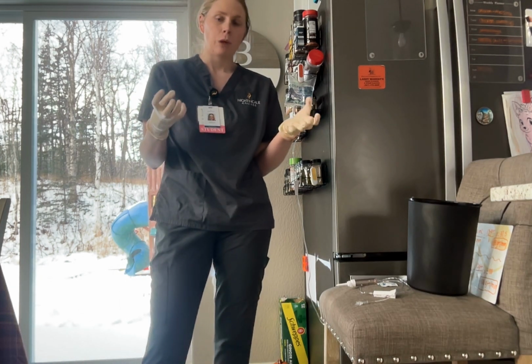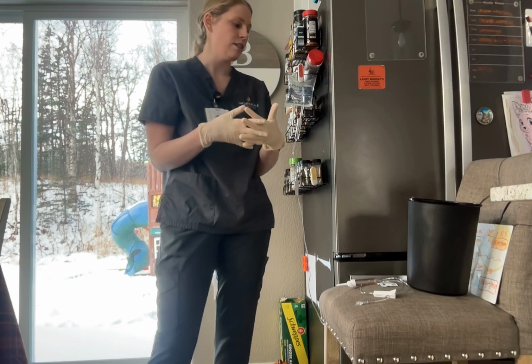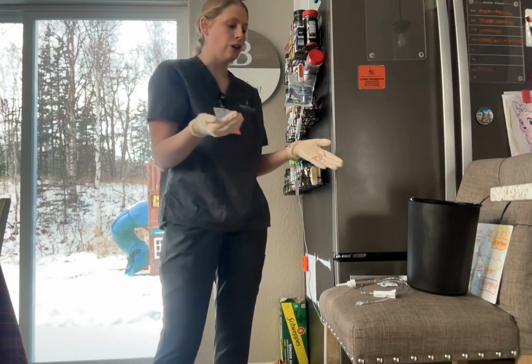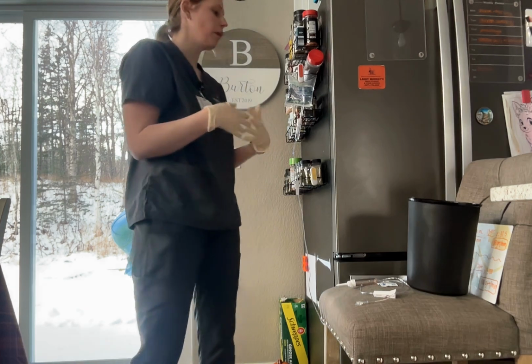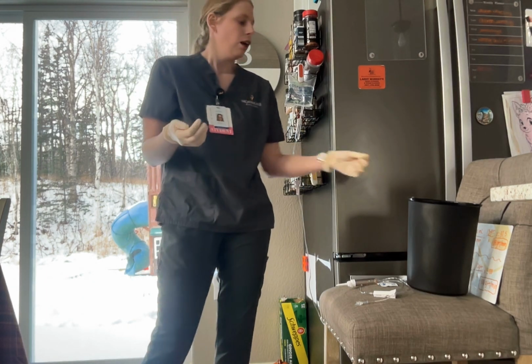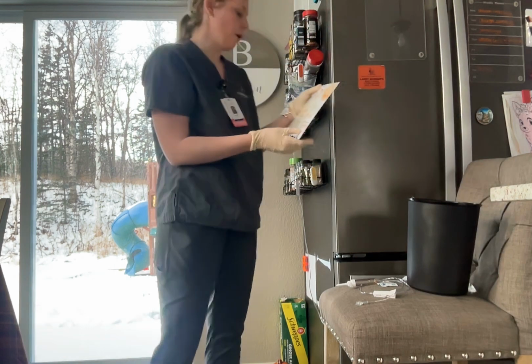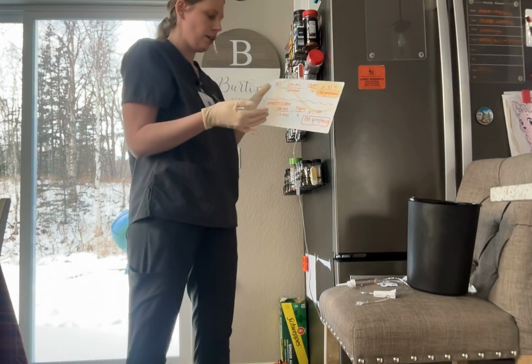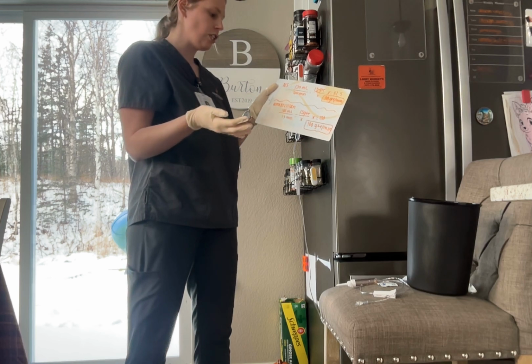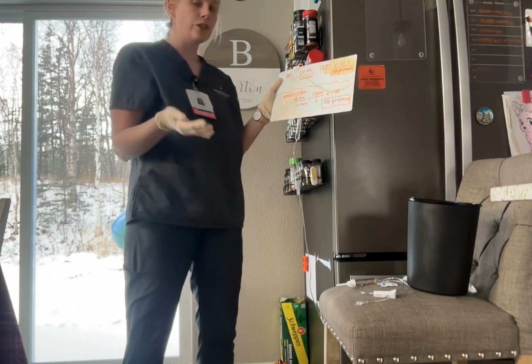Now we're going to go over the medication. The patient is now going to receive amoxicillin, 250 milligrams, which is in 100 mLs. Sir, again, I just want to verify, do you have any allergies? No. Okay, so just to go over the medication, it's 100 mLs in 15 minutes. The drop rate factor is 15 GTT, and that equals 100 drops per minute.